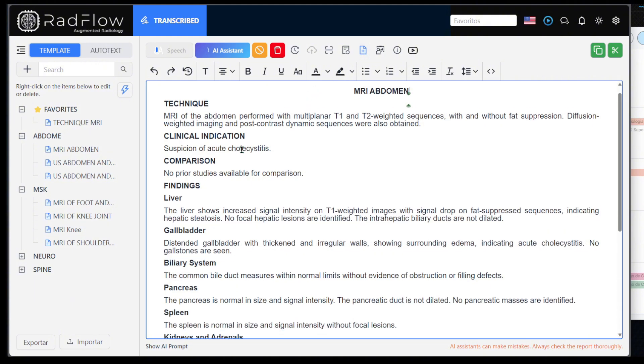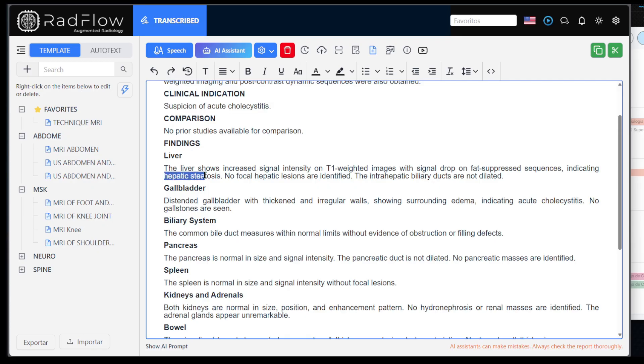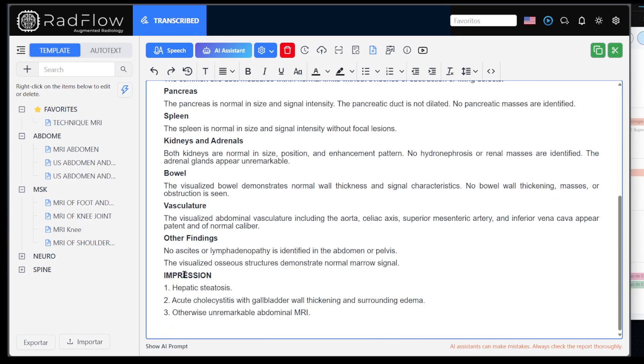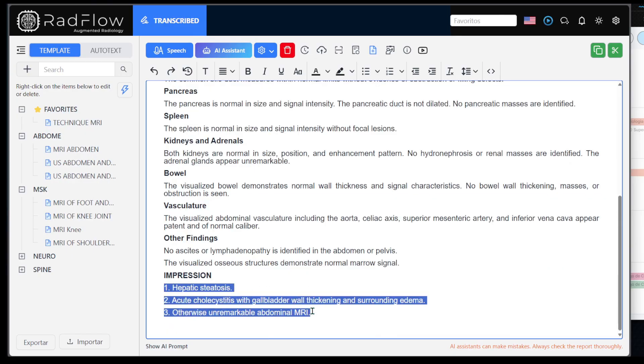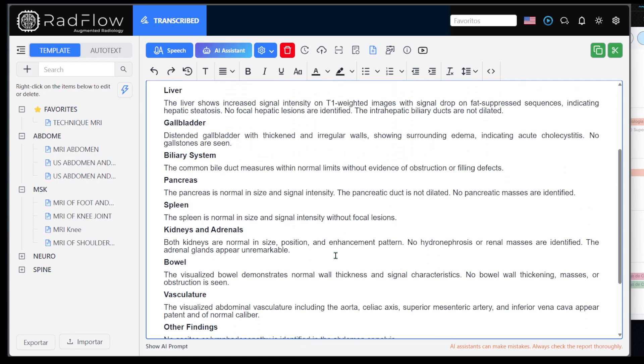Notice that it correctly filled in the clinical suspicion. It also included hepatic steatosis in the liver and acute cholecystitis in the gallbladder. In the diagnostic impressions, it correctly filled in the diagnoses, making it much easier to draft the report.